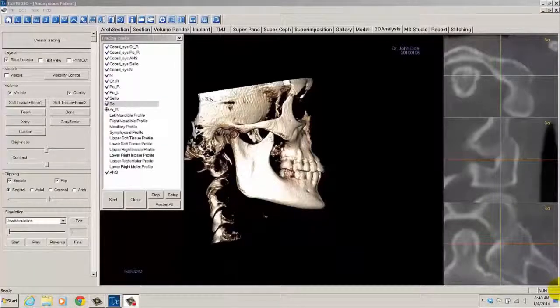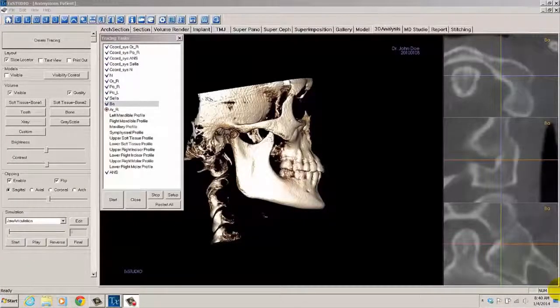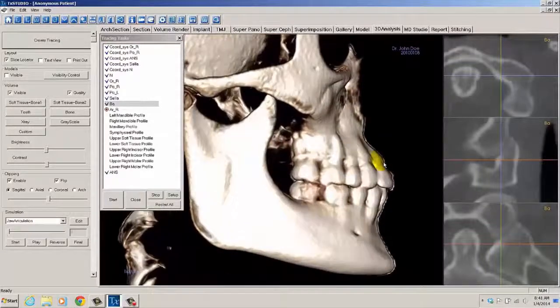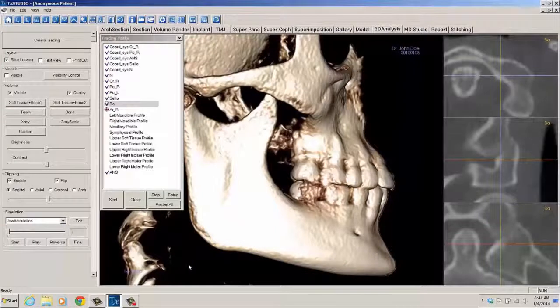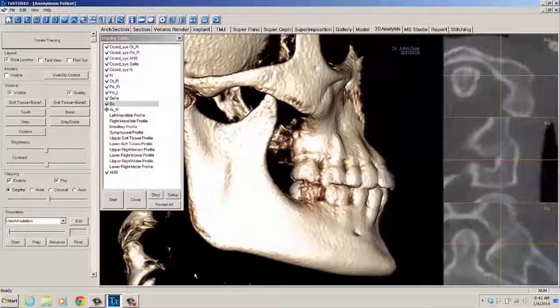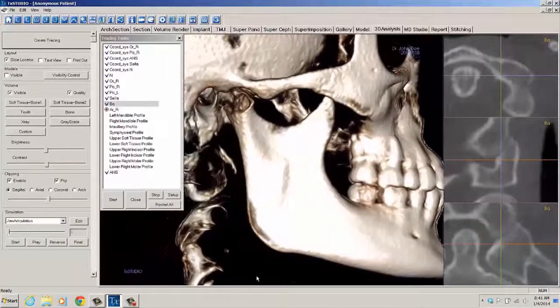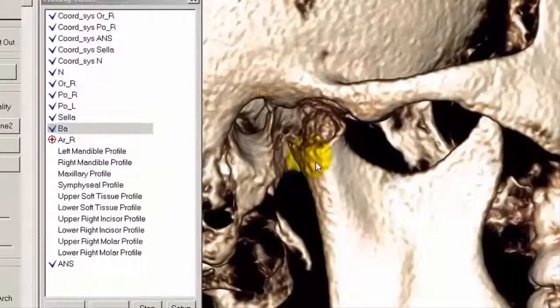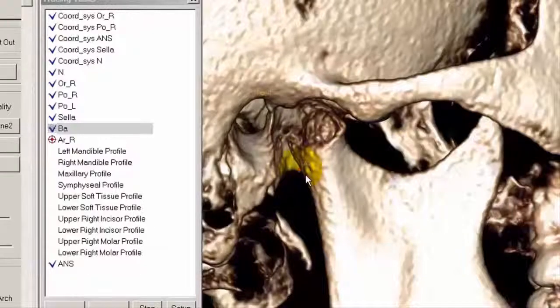Click Create Tracing, double-click Basion, and place the landmark. The last individual landmark we'll place is Articulary Right — the junction of the posterior ramus plane and the temporal bone of the skull. Make the image larger using Control and left-mouse click. Because the plane is hidden, use Shift and left mouse button to pan the image to the right. The landmark is right at the junction from the posterior ramus to the cranial base. Place the landmark point there.